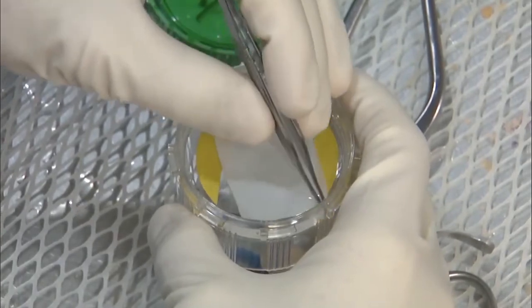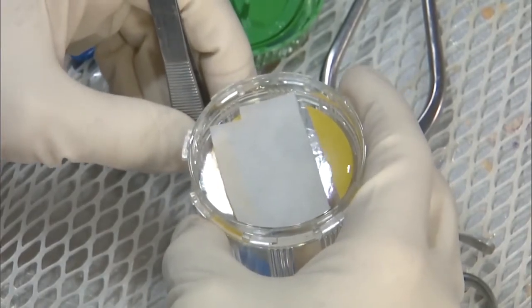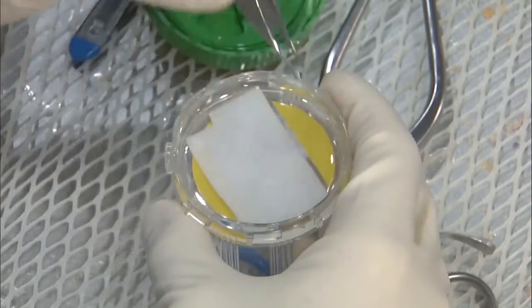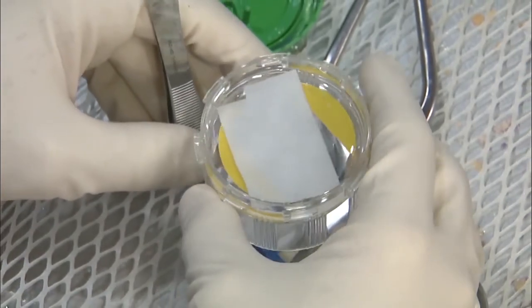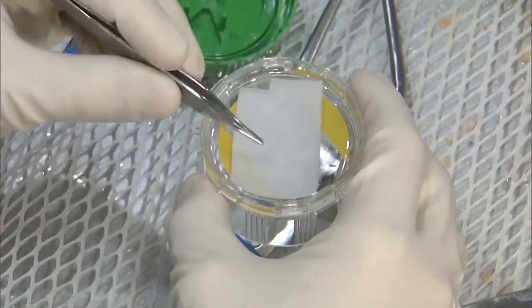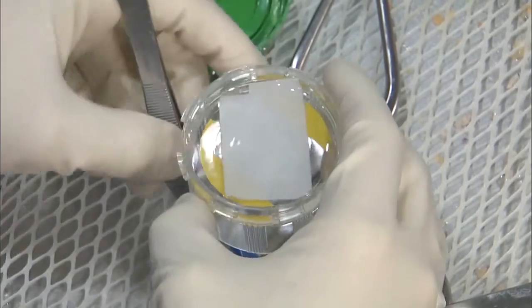One of the other things with growing cells on a membrane, one of the problems with expanding chondrocytes in the lab is that when you get to passage 2 on a petri dish, the cells really lose their phenotype and they undergo dedifferentiation and become almost fibrous-like cells, but grown on the membrane, they maintain their phenotype. So I think that's a big advantage with the matrix-associated ACI.